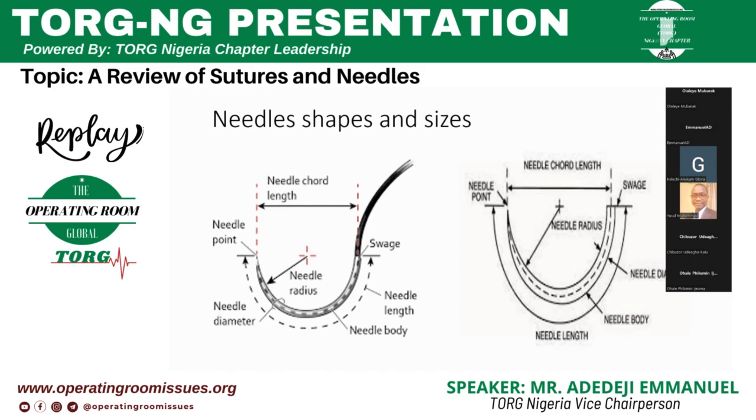These are very strong fibrotic body tissues that require a very strong cutting needle, or sometimes a taper needle, so that you can penetrate and achieve wound closure as much as you can.